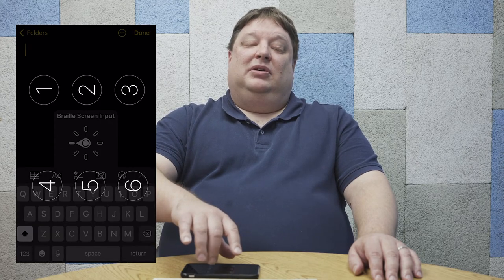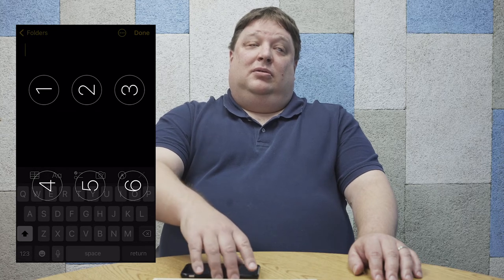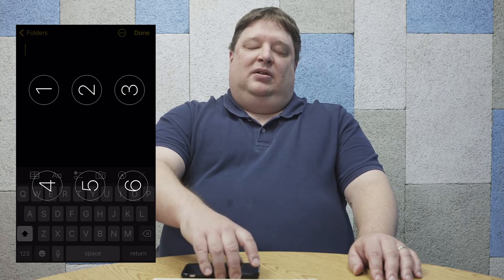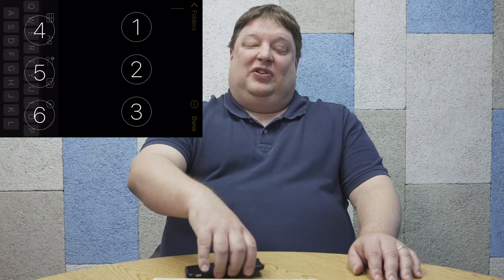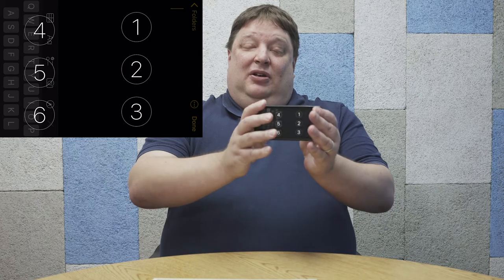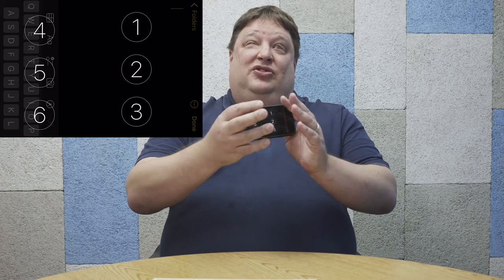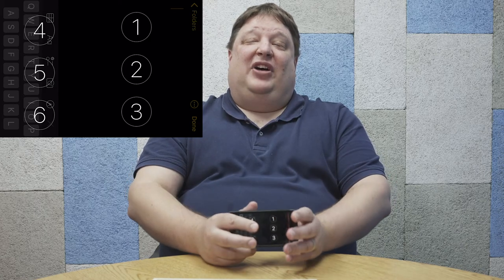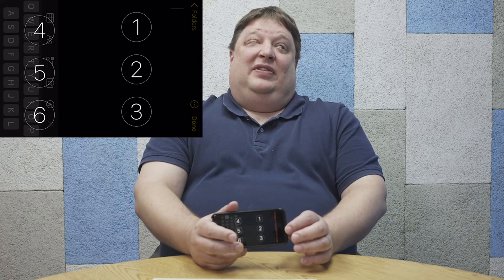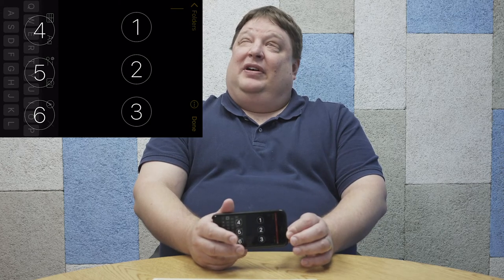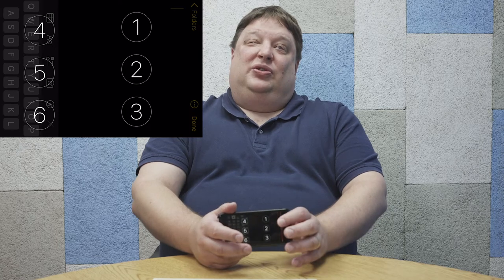The device announces: Braille screen input — orientation locked, landscape, screen away mode, contracting. Now that tells me a few things about how my Braille screen input is set up. It's locked in screen away mode, which means I have to hold the phone with the home button to my right. If I have a device with no home button, that means having the bottom of the device to the right.